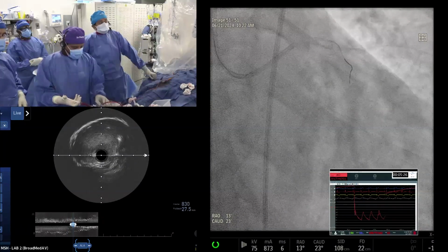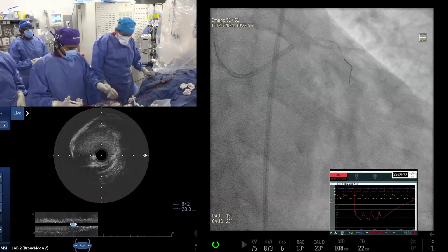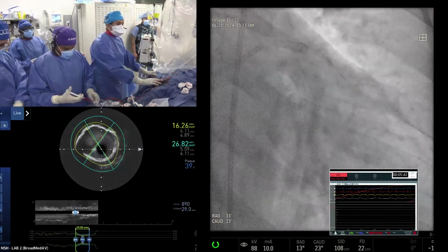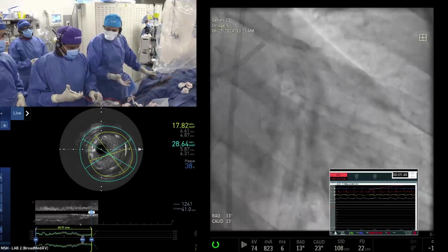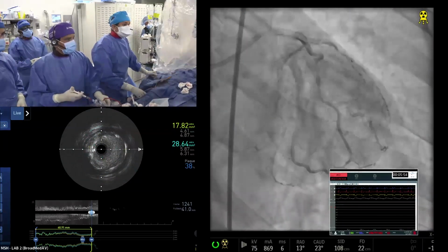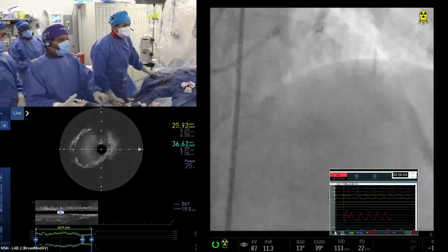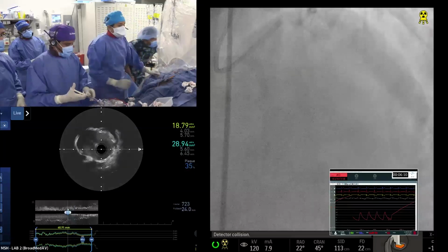The reason is, as long as you have TIMI 3 flow and no chest pain, no EKG changes, none of the above, right? Did nitro, everything taken care of. Okay, good. So this is a caudal, then we will give them a cranial. Nice proximal. Dye. Little flush right there. Let's do another one. Very nice, looking very good. Go to the cranial view. Yeah, you're right. We just have to see the ostial diagonal in some view. If there is some question, then we go back and do the kissing balloon. Then definitely we have to use high pressure. Okay, ready? Okay, good.